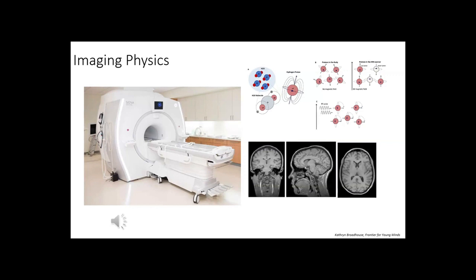Okay, and we use this coil to flip the molecules. They go in the same direction, and then we just wait to see how long it takes for each tissue type to go back to the normal status. So that time is the contrast in this MRI image.